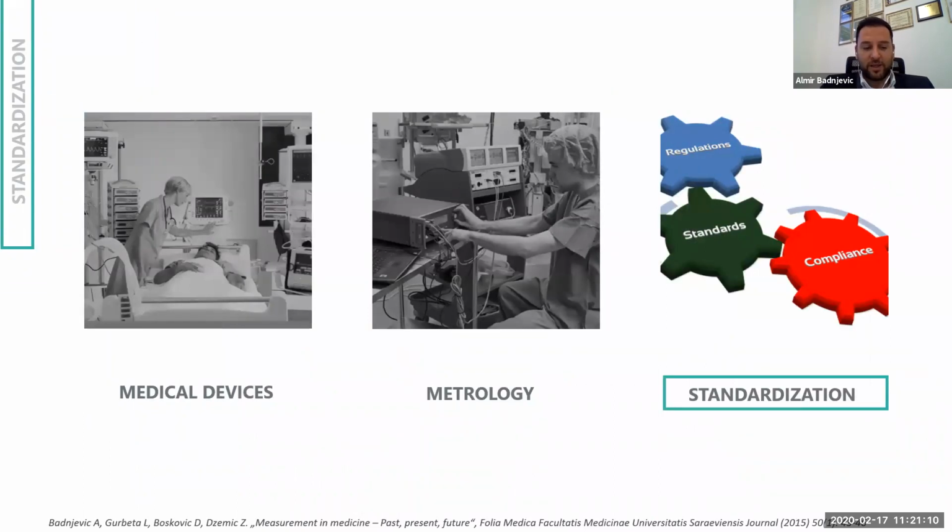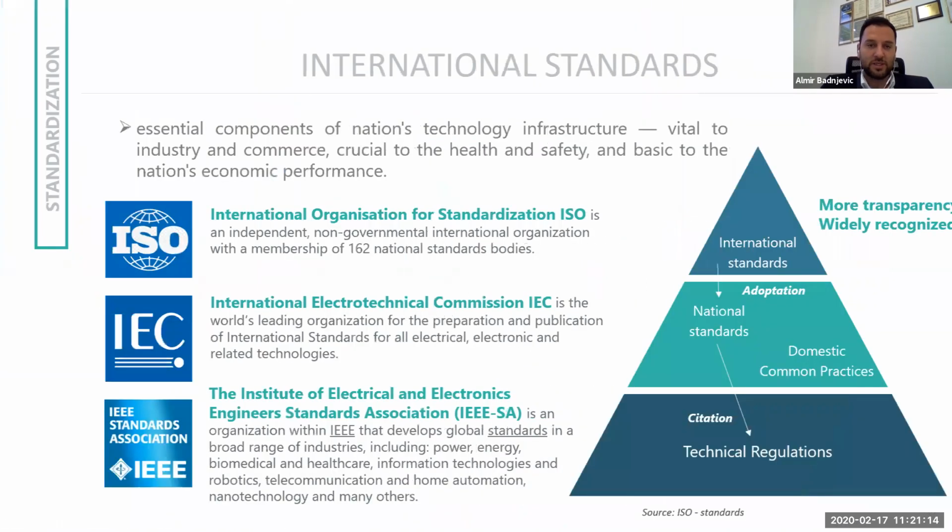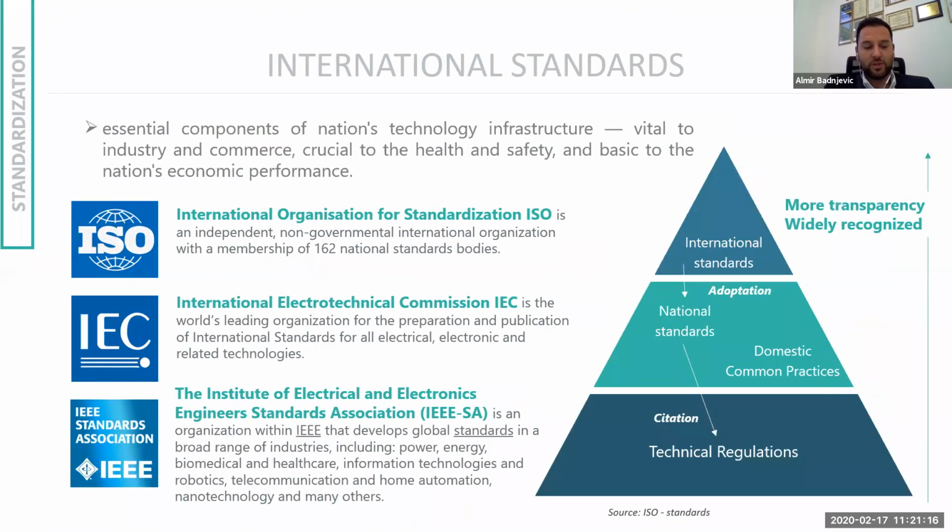And the third part, the third segment here, is in fact the standardization, as I said. So we started with reading the standards and looking at what the main standards are, in fact, what are the main important standards here. And when we are talking about medical devices, there is definitely ISO, there is definitely the International Electrotechnical Commission, and there are also IEEE standards, which are here.